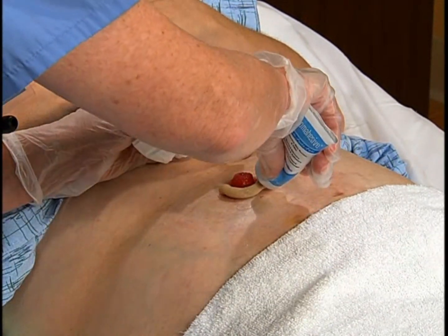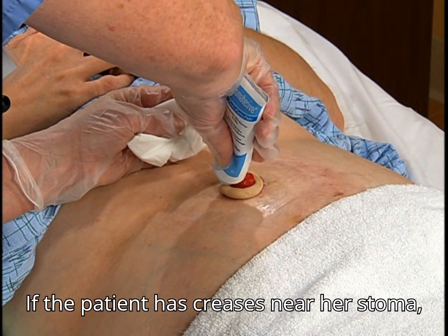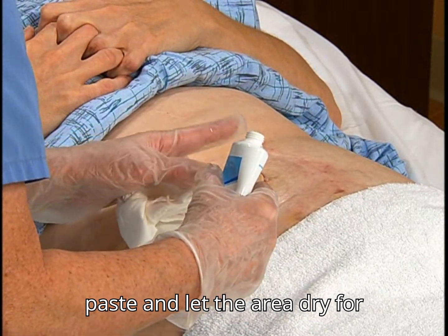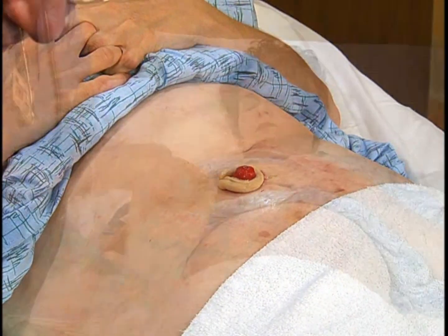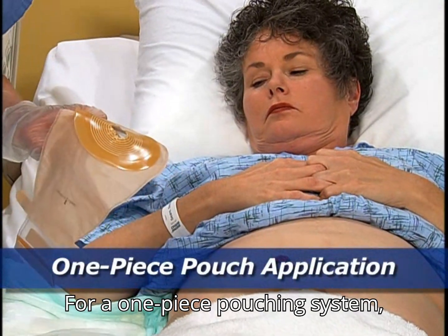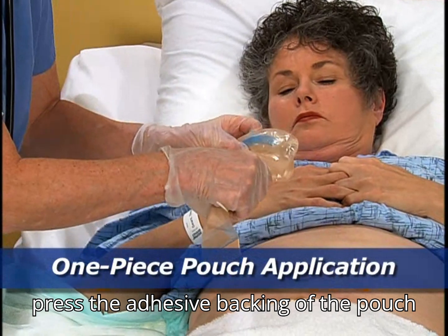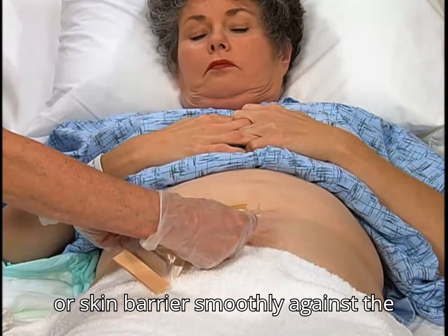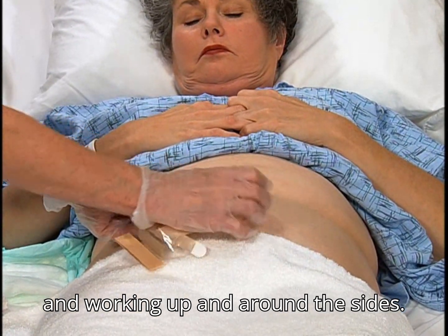Now put on gloves again. If the patient has creases near her stoma, fill them with stoma adhesive barrier paste and let the area dry for 1 to 2 minutes. Then apply the skin barrier and pouch. For a one-piece pouching system, press the adhesive backing of the pouch or skin barrier smoothly against the skin, starting from the bottom and working up and around the sides.